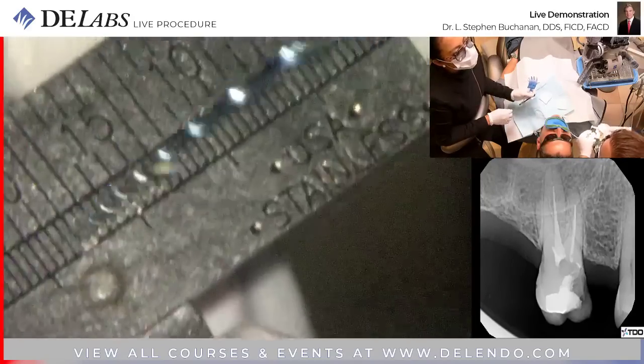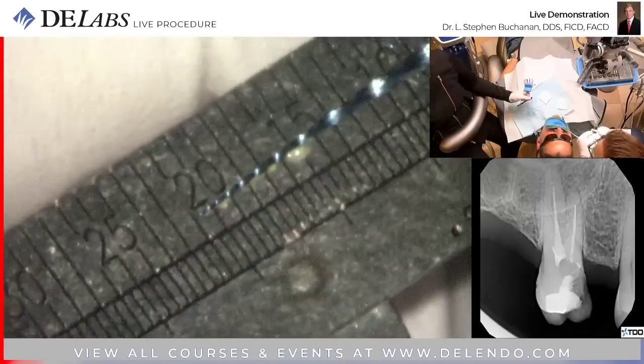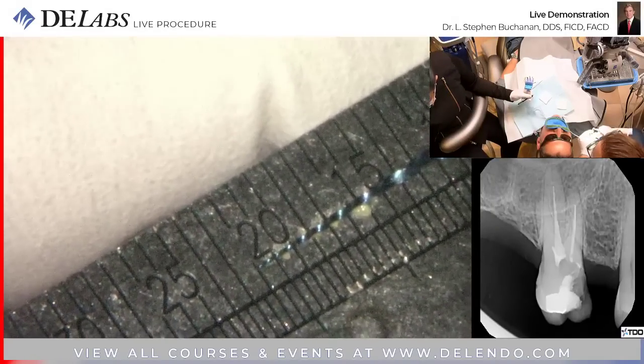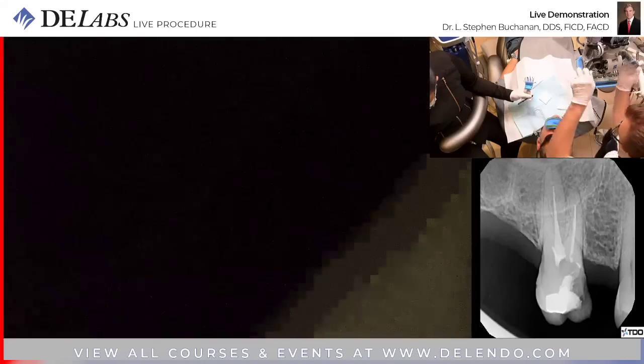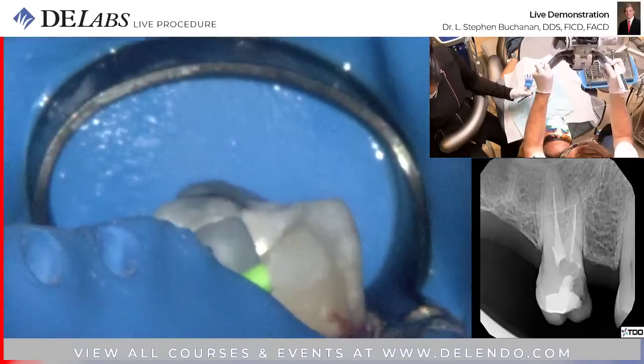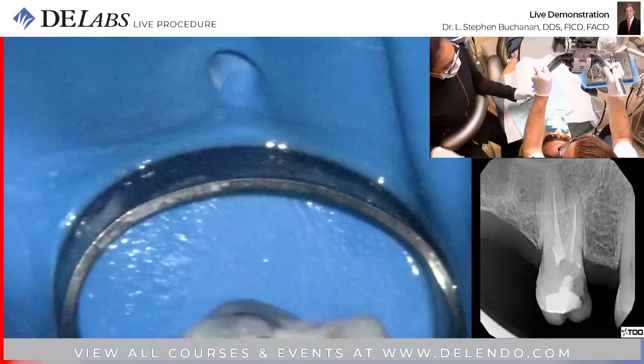Palatal canal by the palatal cusp tip is 20, and call it 21. 21. Yep. Let's do the MB1.